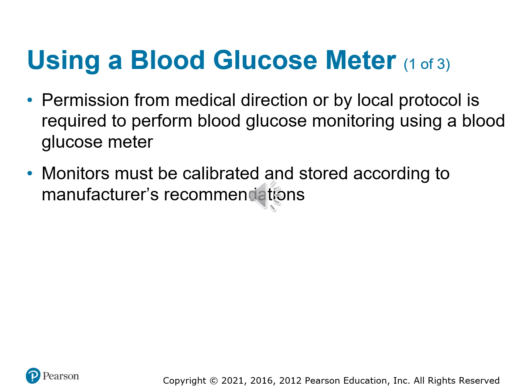And there is a separate licensure that the service would have to carry in order to utilize the blood glucose monitor, called a CLIA license. Again, not something that you need to be overly concerned about as an EMS provider, other than knowing there are a few rules and regulations when it comes to actually having a blood glucose meter and using a blood glucose meter.